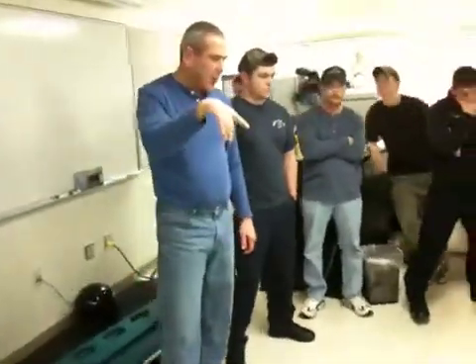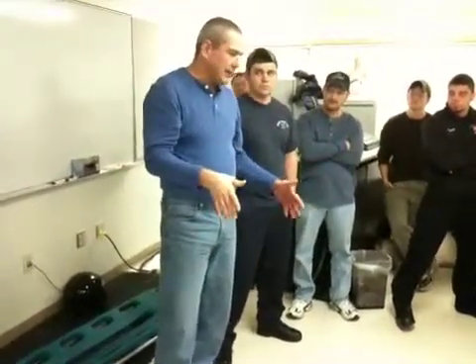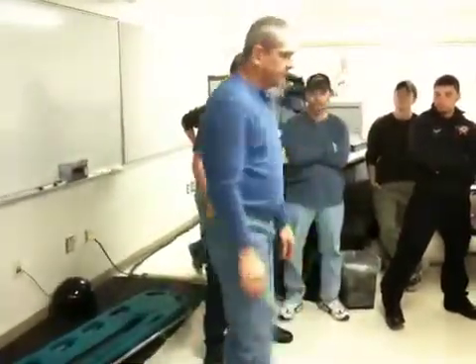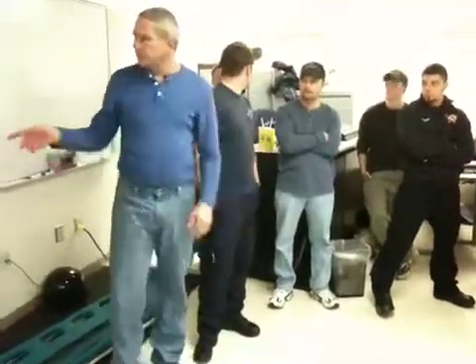Now, would it have been appropriate for this victim in a car wreck to be walking around holding her neck, or his neck? Okay, we're going to put the spine board on the cot, get on it, lay down. What do I have to do? Sit and then turn. That's not appropriate. This is appropriate. Do y'all use this a lot? Yeah. Interstate all the time. Exactly.